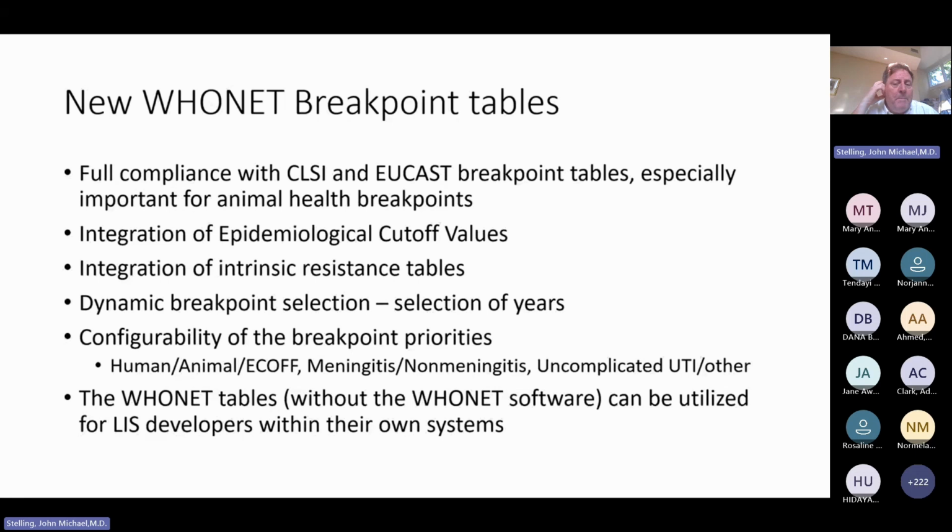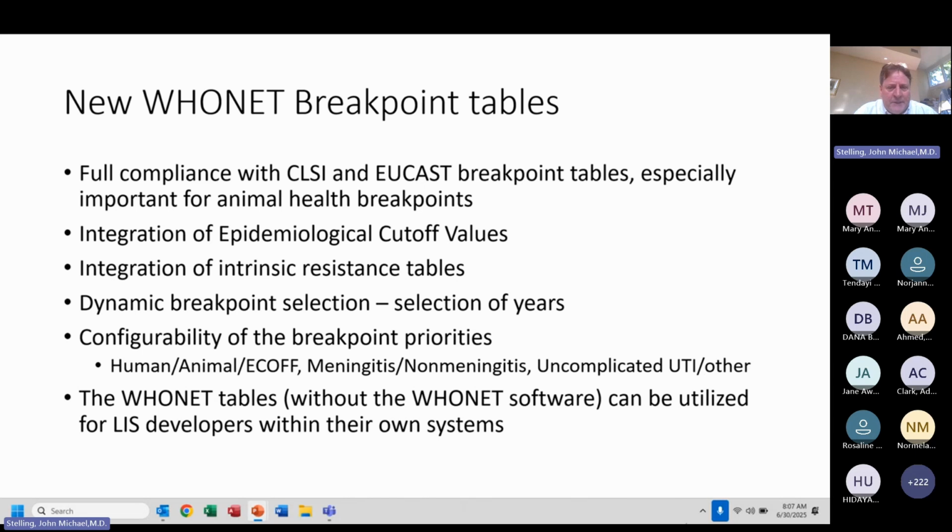So there are bacteria that are clinically susceptible and the patient should get better, but are still a little bit resistant. Then the epidemiological cutoffs have that other objective, to find resistance genes from a phenotypic perspective. It used to be known 30 years ago as microbiological resistance or susceptibility. So clinically susceptible means that the patient should get better, even if there's a resistance gene. ECOFF wild type is the expression we use. Wild type means there's no evidence of a resistance gene from a zone diameter or MIC perspective. So with our new tables, we can support the ECOFFs.